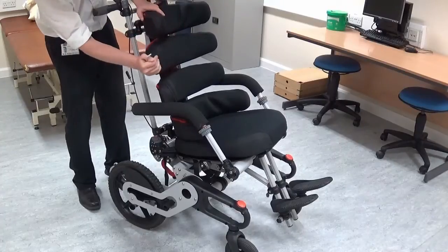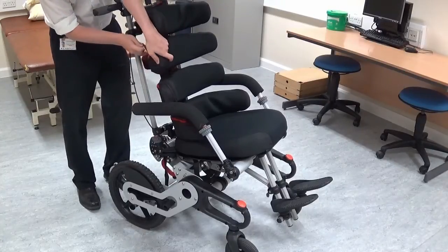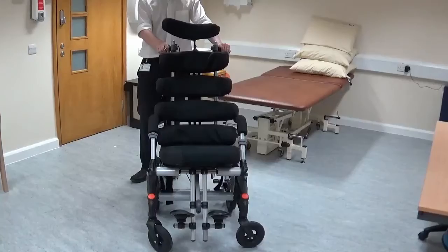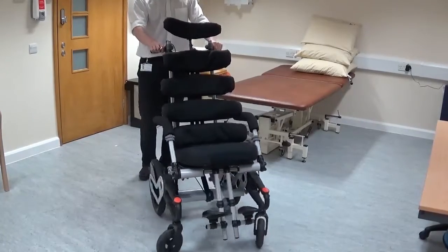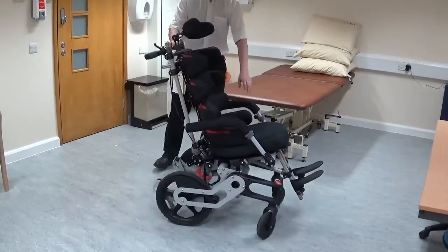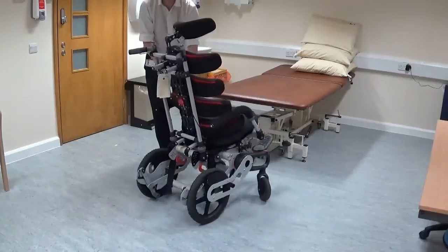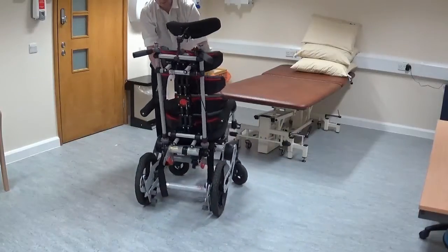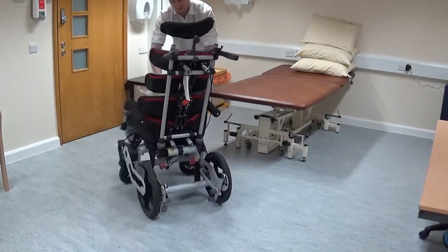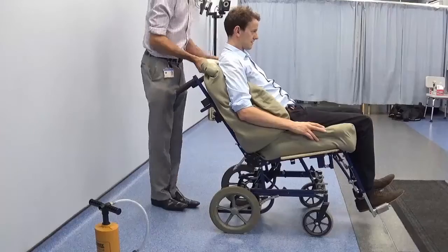There is a range of equipment available to provide support to people with complex postural shapes. These products are available off the shelf. However, when off the shelf solutions do not offer adequate support, a custom contoured product may be required.